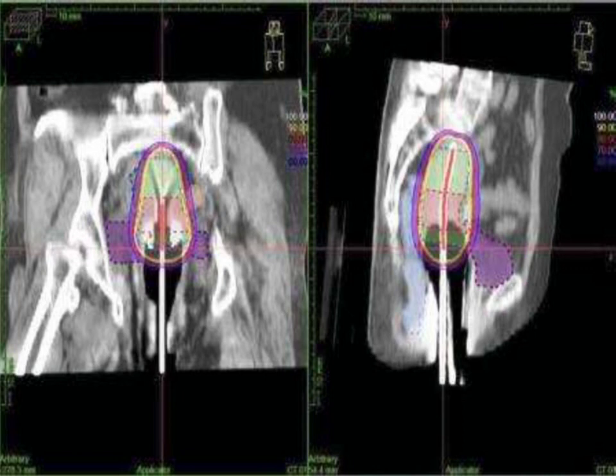Finally, brachytherapy planning requires military discipline. The radiation oncologist must be fully aware of each and every applicator and its dimension and length. The third point is that the tip of the applicator and the first dwell point must be very clear. The fourth point, an extension of the third, is that the travel of the source from the catheter tip to the first dwell point is called the indexer length.